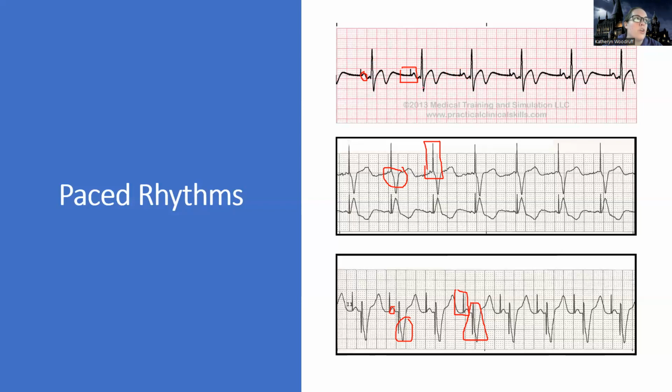The reason they have this wave after the pacer spike is because they're being paced. In other words, if this pacemaker was turned off, they wouldn't necessarily have all these beats, because pacemakers are what's called demand pacemakers. Let's say my heart's not working and I have a pacemaker placed. My heart rate's probably already low, hanging around 55. The doctor sets the rate to 70, which means my heart has to beat 70 beats per minute. Now let's say I'm up in the kitchen cooking, working out, chasing after my 5-year-old, and my heart rate goes up to 80 by itself.